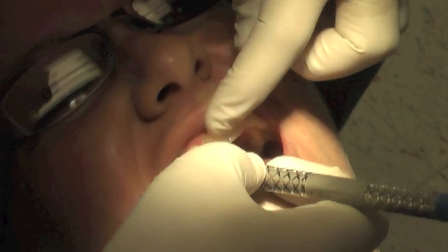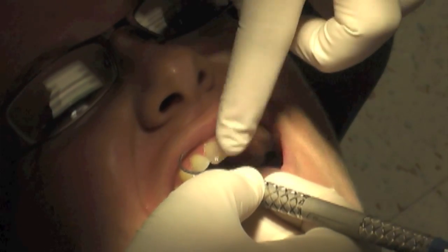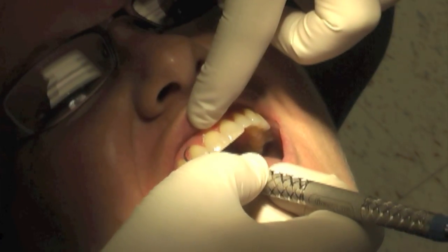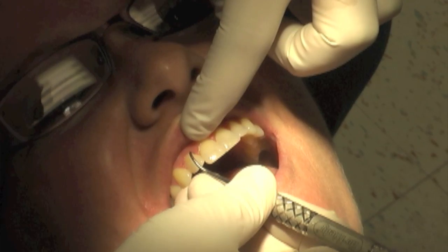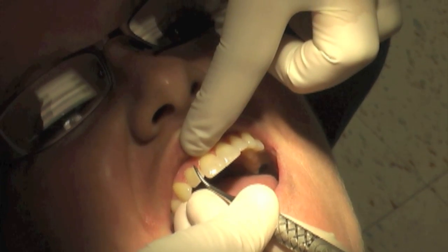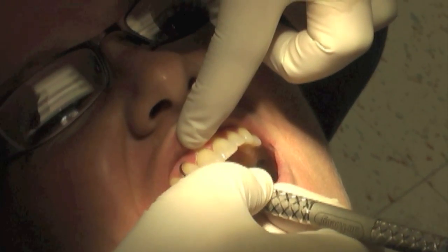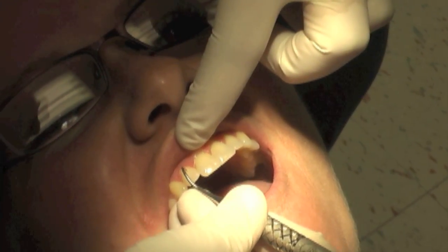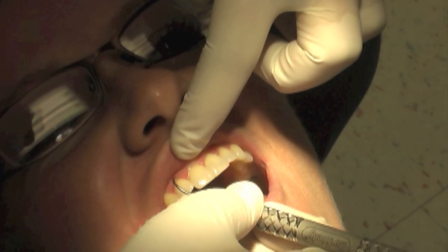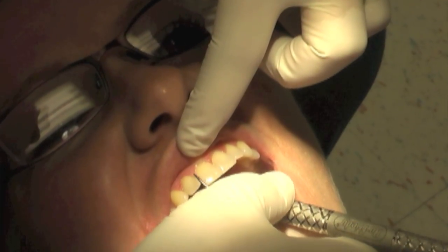The other thing is that you might be able to keep your thumb this way, but then as you turn, your thumb could drop down instead of coming up as you're coming around. So try to always keep your thumb out.